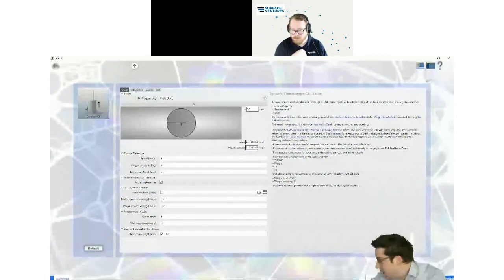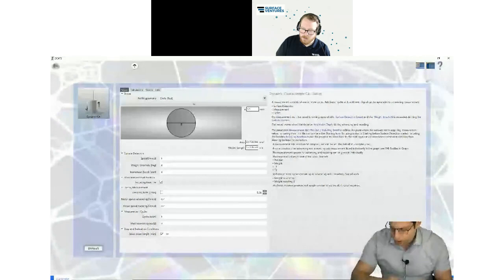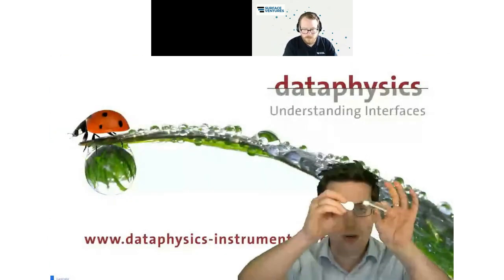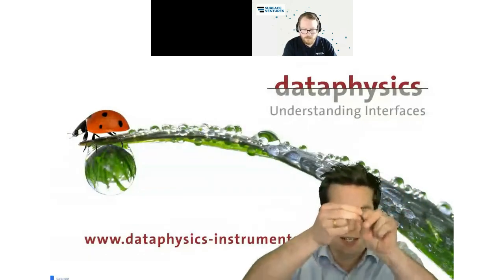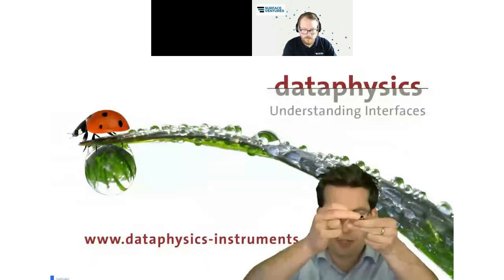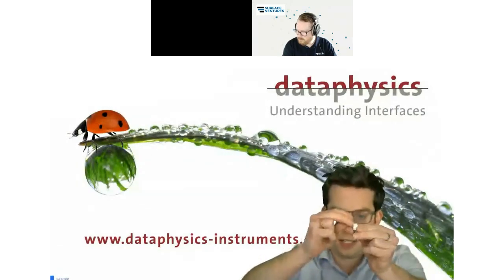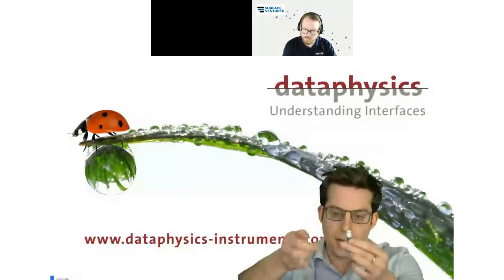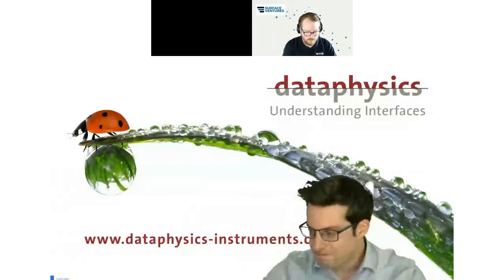For the implant that I have used now, I have the box for it here. I'll show you, because you have probably never seen how this looks. Implants come in this kind of box, and the implant is stored in a cylinder. Then you have a piece on top, and in here is a little screw that is used to fix the implant. This whole thing comes in these kinds of screw vials.